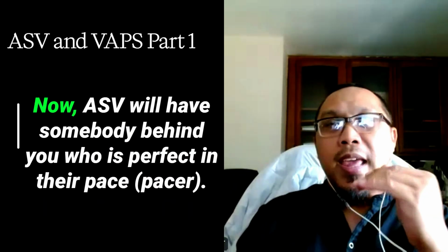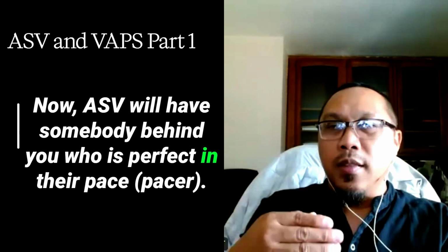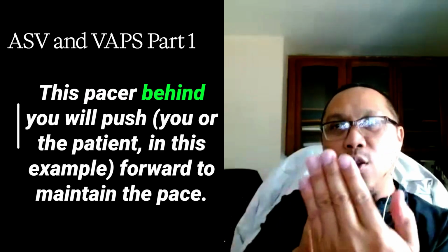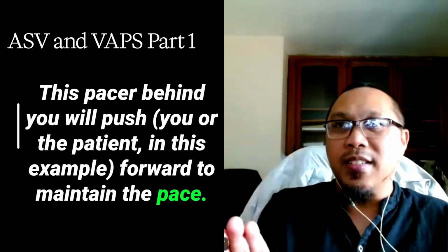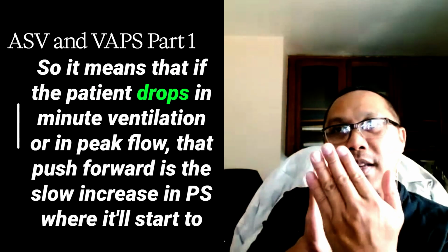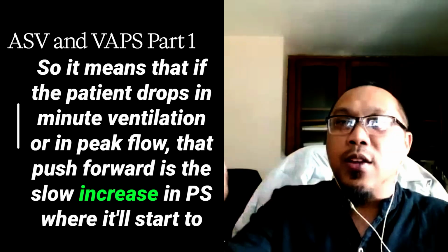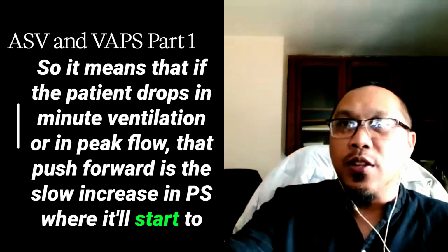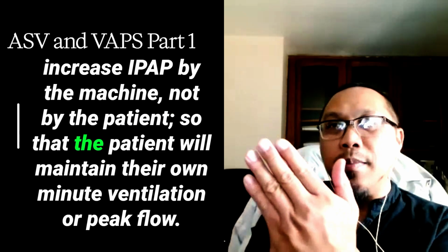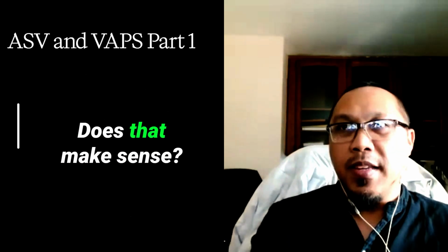Now, ASV will have somebody behind you who is perfect in their pace. So if you start to slow down, this pacer behind you pushes you forward. They maintain their pace. It means that if the patient drops in minute ventilation or in peak flow, that push forward is the slow increase in pressure support by the machine, not by the patient, so that the patient will maintain their own minute ventilation or peak flow. Does that make sense?